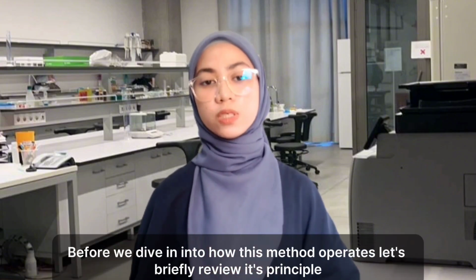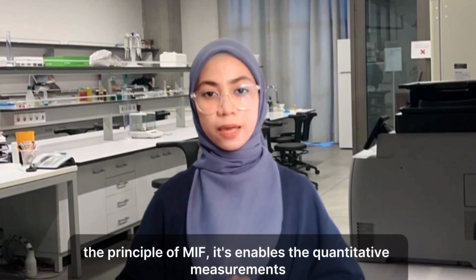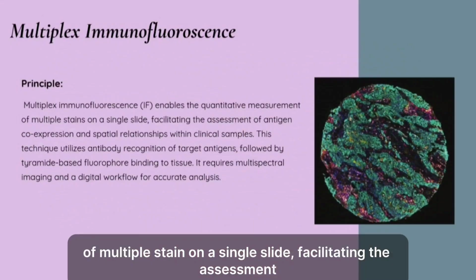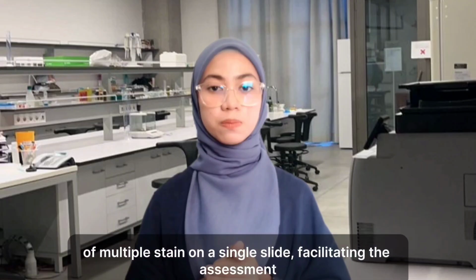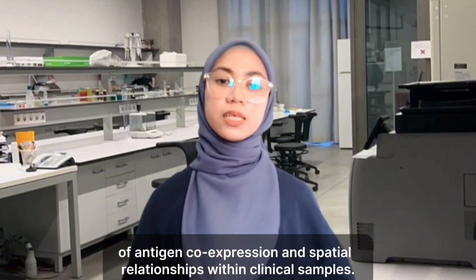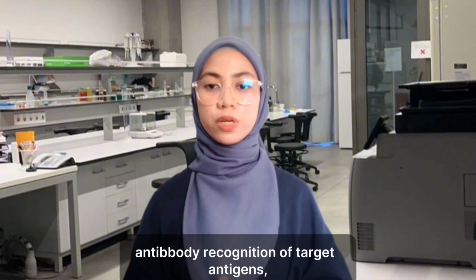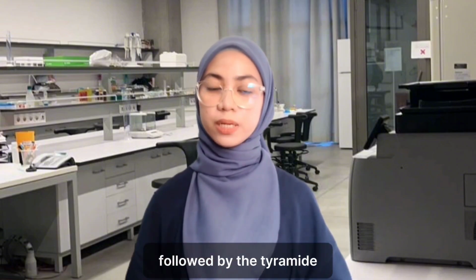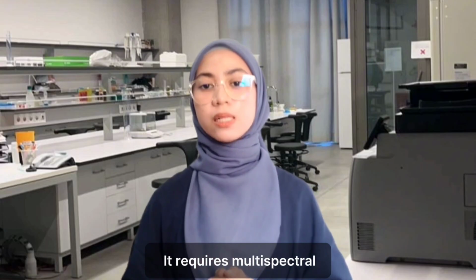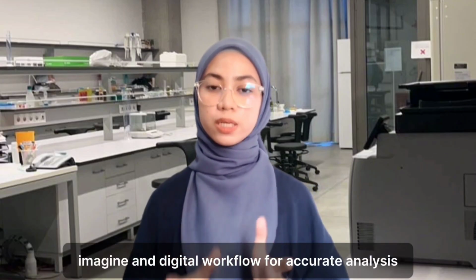Before we dive into how this method operates, let's briefly review its principles. The principle of the MIF is to enable the quantitative measurement of multiple stains in a single slide, facilitating the assessment of antigen co-expression and spatial relationships within the clinical samples. This technique utilizes antibody recognition of the target antigens followed by tyramide-based fluorophore binding to the tissues. It requires multispectral imaging and a digital workflow for accurate analysis.